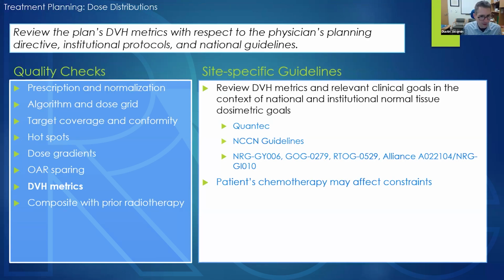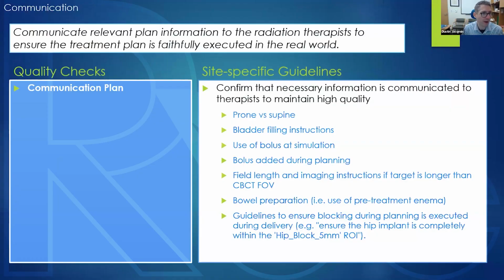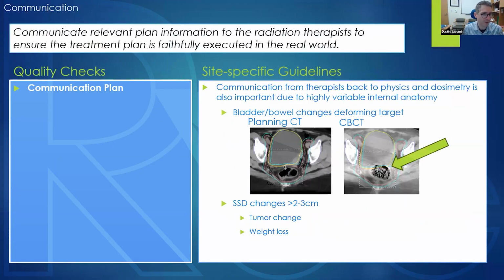I'm not seeing any other questions. I just wanted to reiterate something you said in the last couple slides, which is we've talked about the communication plan a lot in these presentations as sort of a one-way communication stream between physics and the planning process and the therapist. But you're absolutely right that it's not a line, it's a loop. And a good communication plan will have opportunities for the therapist to feed information back into the planning process, whether it's patient-specific and very short-term or longer-term via incident learning.